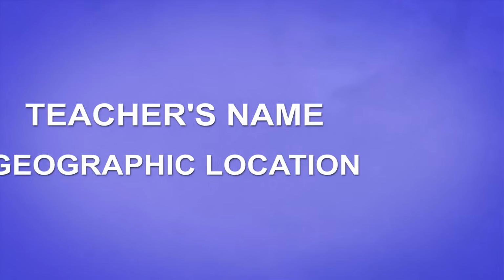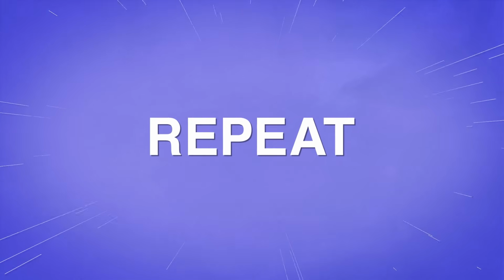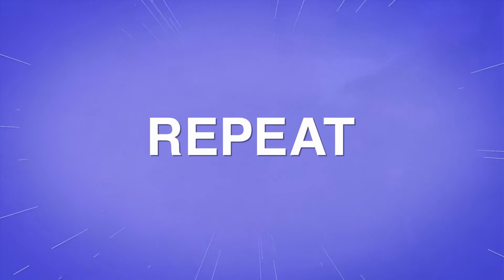Encourage team members to be descriptive in addition to a code name and state there is a medical emergency in room blank. Include the teacher's name and geographic location. You will want to instruct your team to repeat this announcement twice to ensure rescuers hear it and are clear on location.